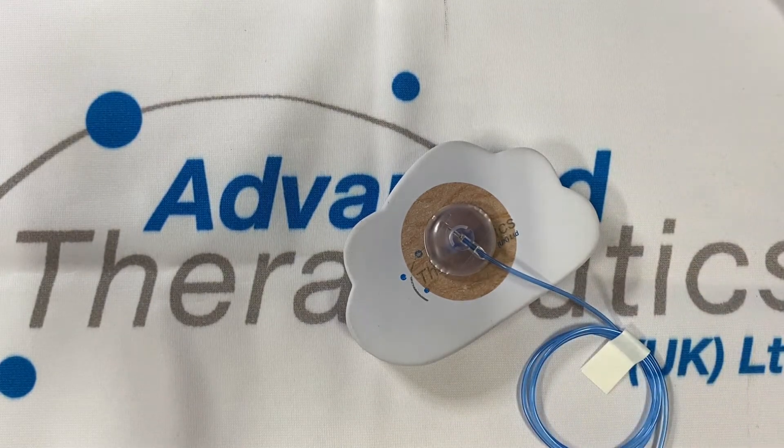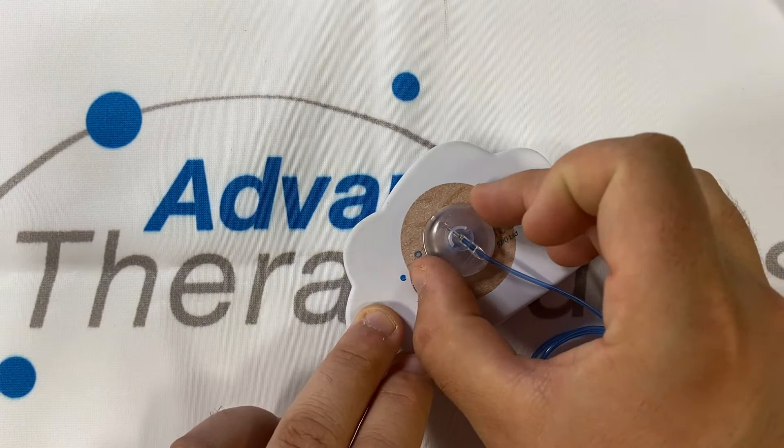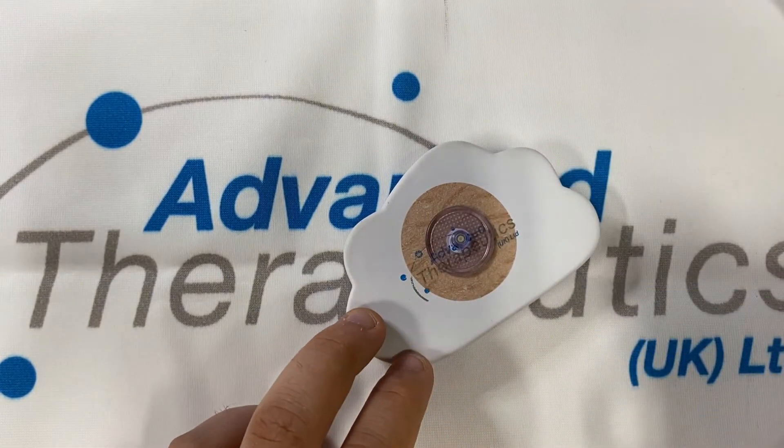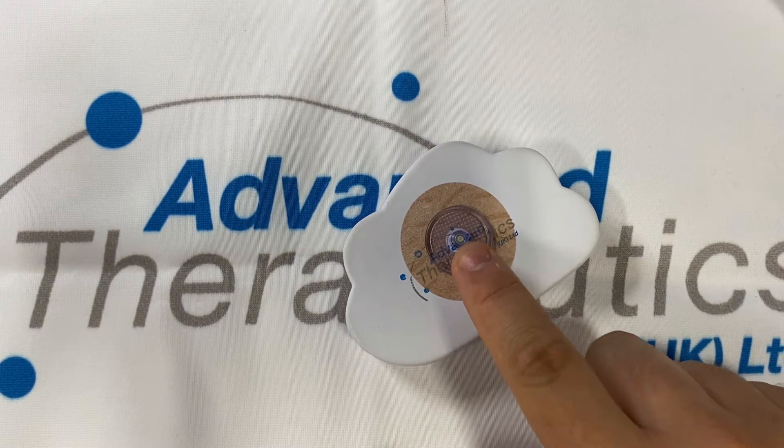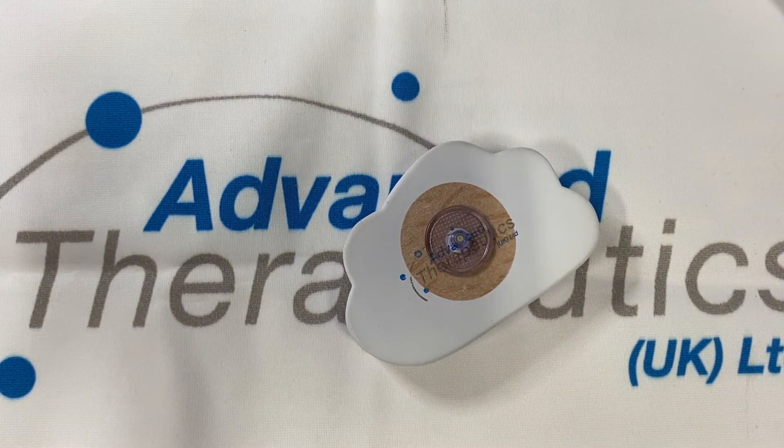When it comes to detaching the set it's as easy as pinching on either side and lifting straight up and off. The cannula left behind has a self-seal membrane so no need for caps and covers. This is waterproof and will keep out any dirt and debris.